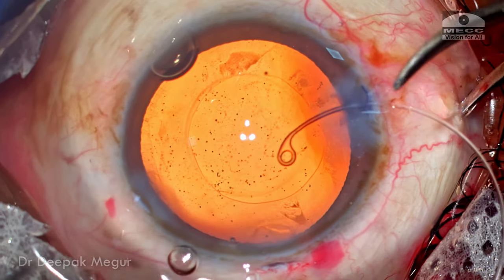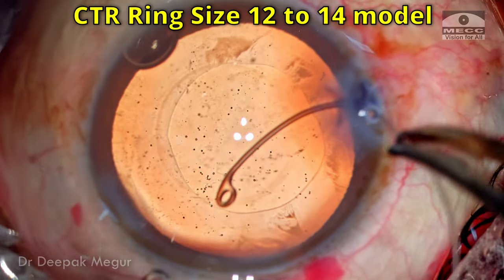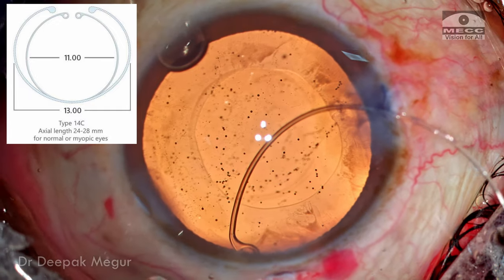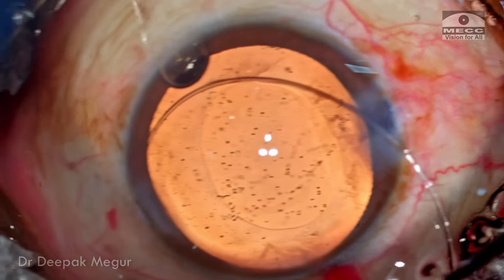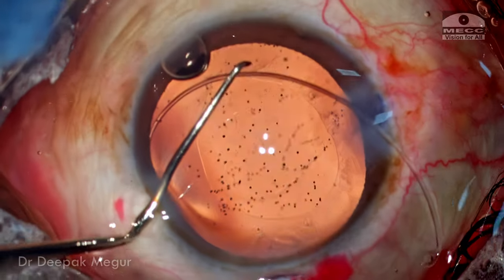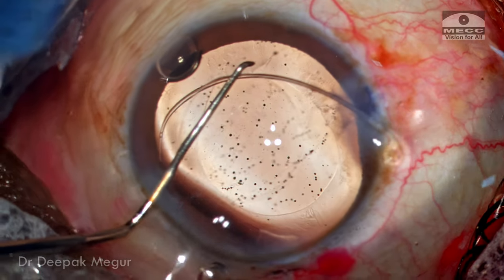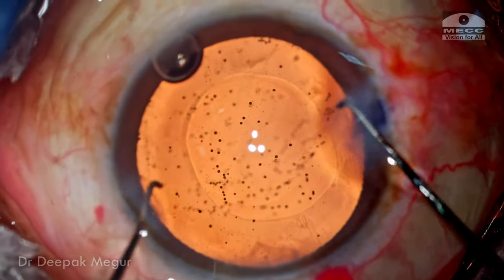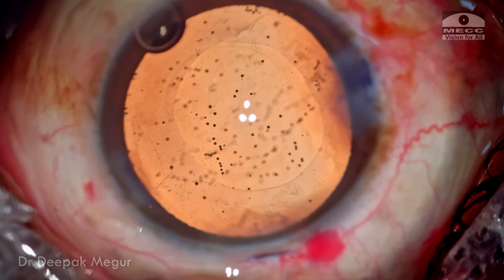Before implanting the intraocular lens, I want to introduce a CTR into the bag. The CTR I'm going to use is the bigger one — the 12 to 14 model. The usual CTRs used for average axial length eyes are the 11 and 13; the one I'm using is 12 and 14. The idea behind using a CTR is that when the ring is inside the bag, the bag becomes taut and the posterior capsule is slightly pushed forward, ensuring it adheres to the optic of the lens and achieving better long-term centration for these hydrophobic lenses. The CTR is now nicely introduced manually into the fornices of the capsular bag.